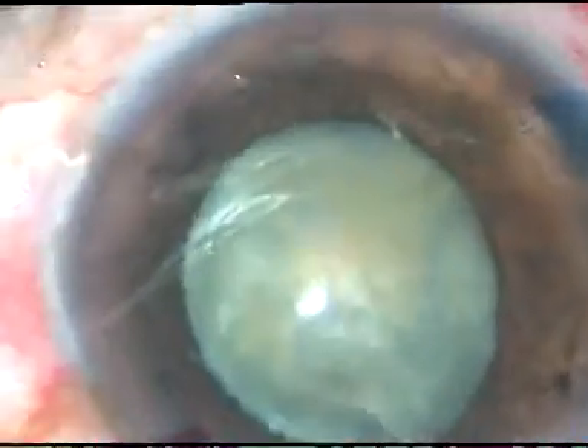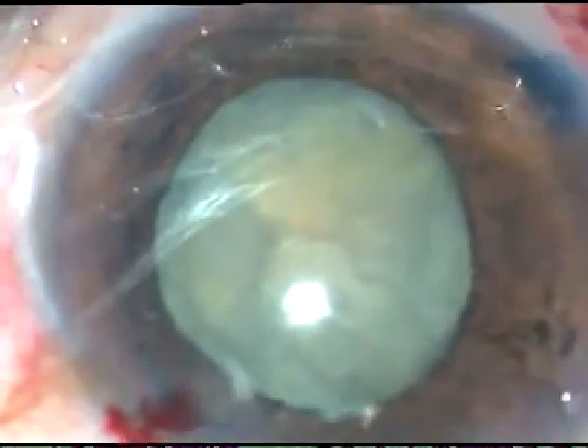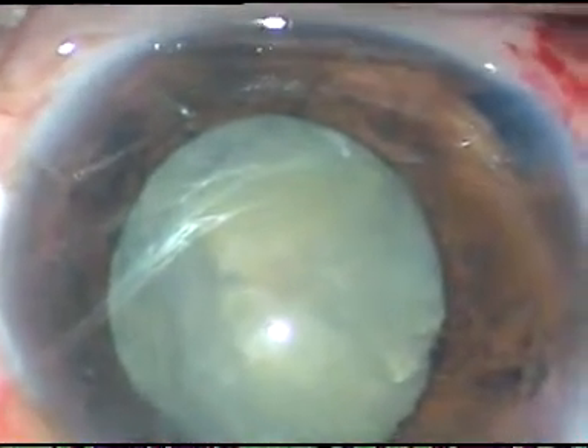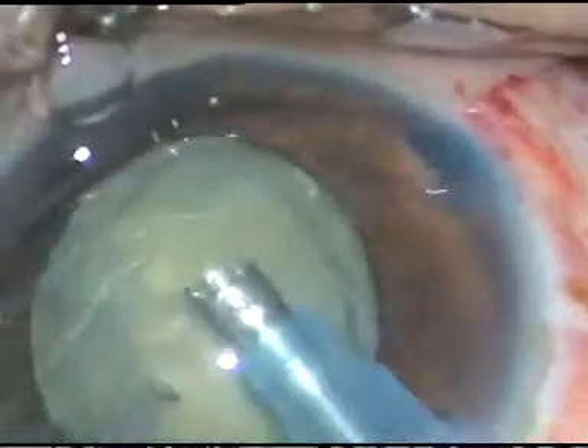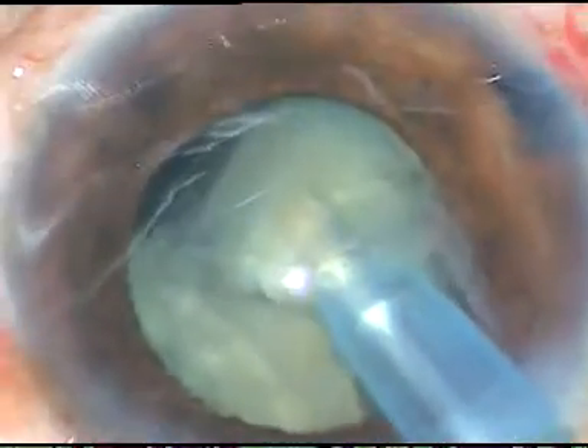You can see that the nucleus is rotating. I have planned to hold the nucleus without causing any pressure over the posterior capsule and over the zonules. I want to chop this nucleus into fragments and then emulsify the fragments one by one. I have decreased the bottle height a little bit, and flow rate and vacuum have been reduced. But vacuum is sufficient to hold the nucleus and chop it. You can see that the pupil is becoming small but manageable.